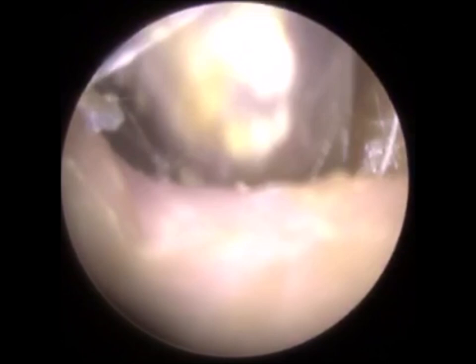So just going back to the video, I've just about managed to get this plug out from that trench, that crater in its mastoid cavity on the left hand side, and you can see how big it is. You would think this is it. Once I've got this out, that is all that's in the ear left.